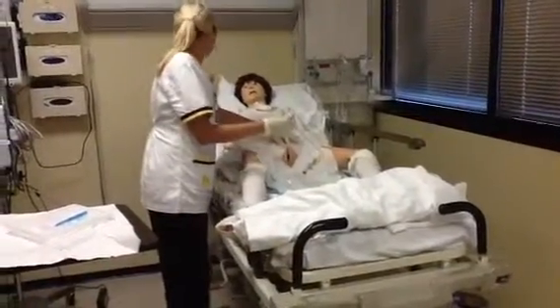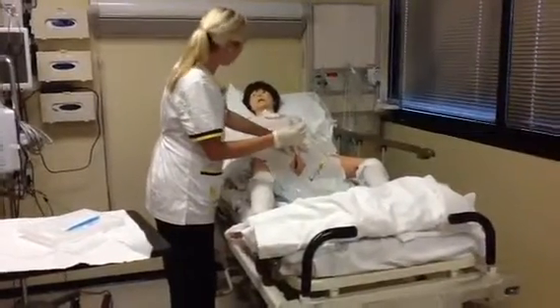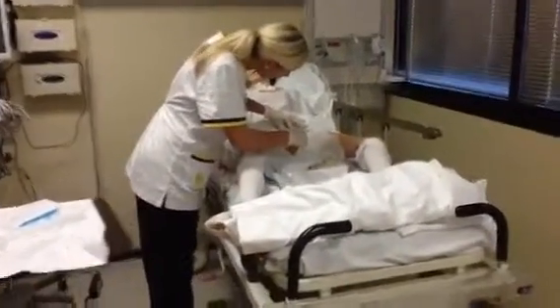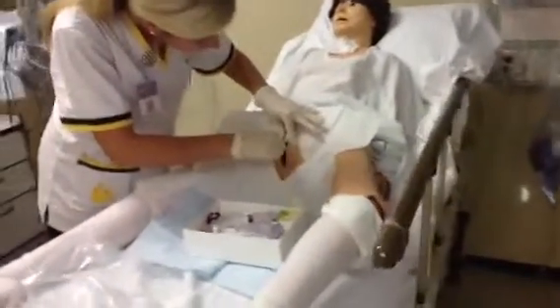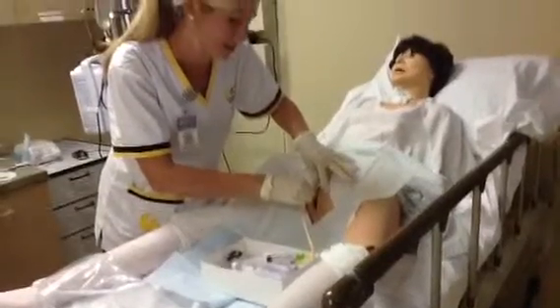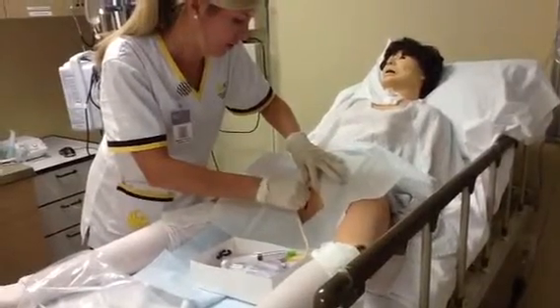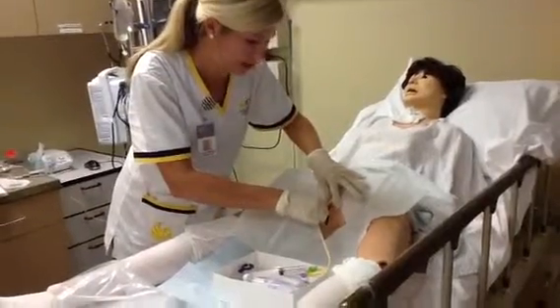So now I'm going to go ahead, and Mrs. Knight, I'm about to insert the catheter, so if you could please bear down with me, and you might feel a little bit of pressure. So I'm going to go ahead, making sure not to touch anything, and insert. Making sure not to feel any resistance. And then again, once I start to see some urine, I'm going to insert 1 more inch, making sure my hands and my gloves don't touch anything.